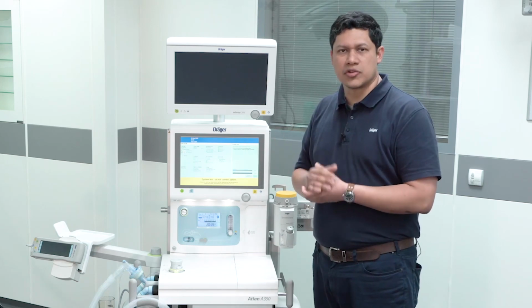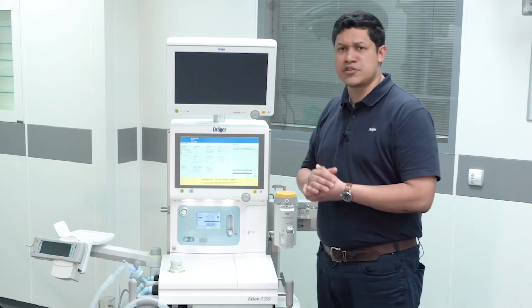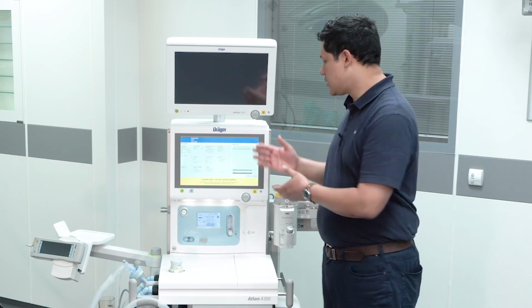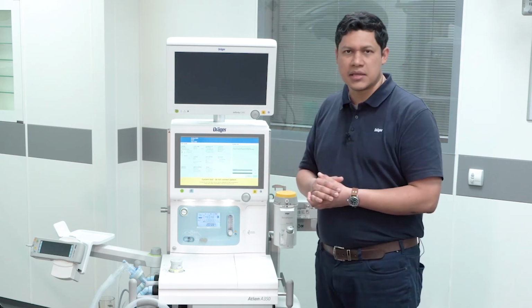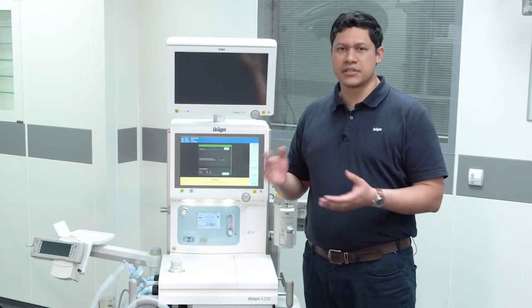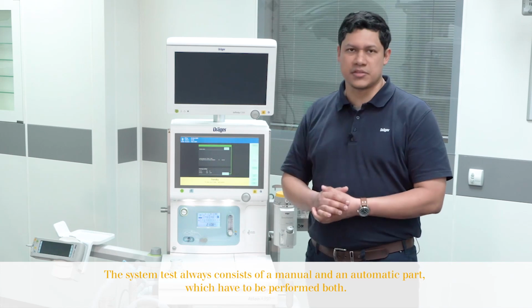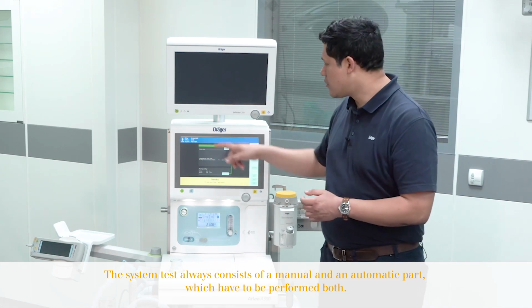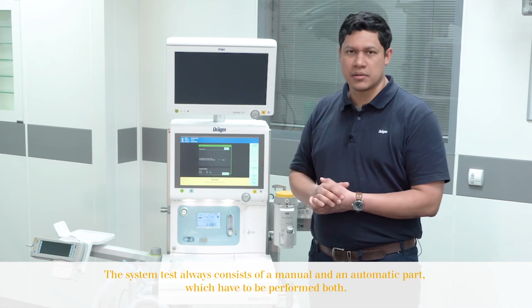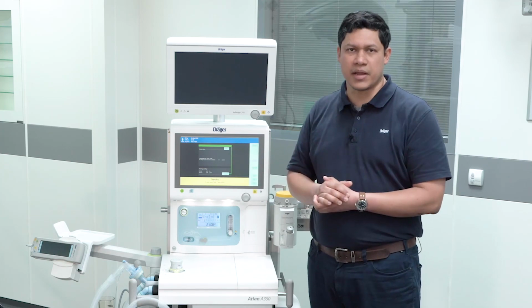Notice that there are two parts in the self-test. In the first one, during the initialization phase, just stay right next to the device. Once this session has finalized, then you can continue with another task. After the self-test has finalized, the system will take you to the standby display. Here you can see through this green flag that the system is fully operational. Once you are in this stage, you can start using the device for mechanical ventilation.